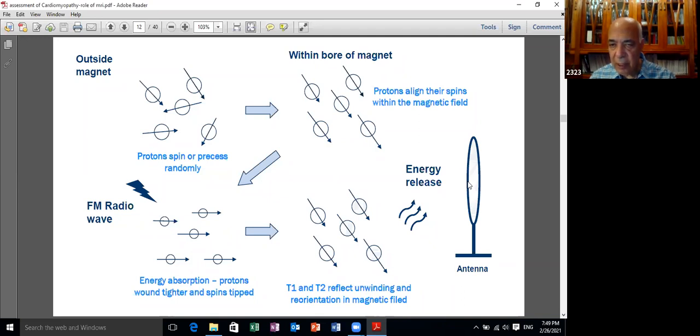I have been asked several times, what's the Fourier transformation equation? It's a mathematical method by which we change waves into lines. And these lines are the pixels from which the picture is formed.